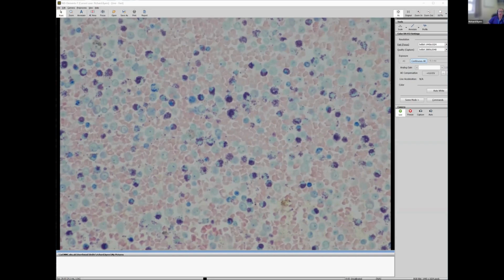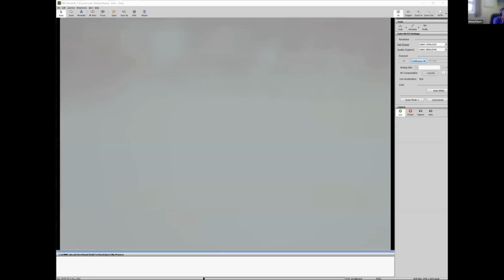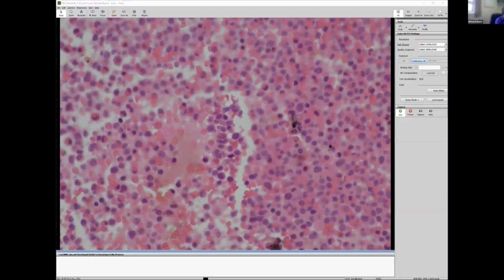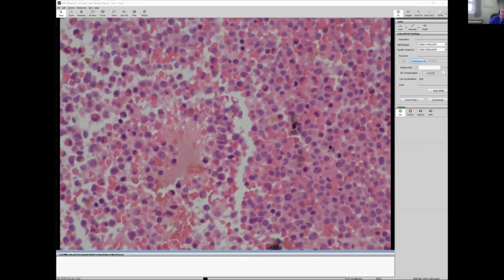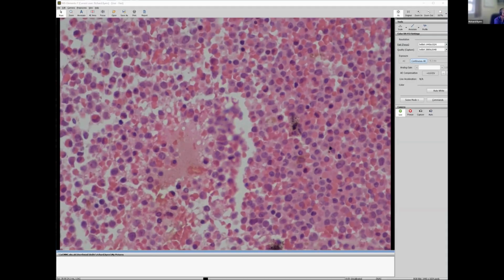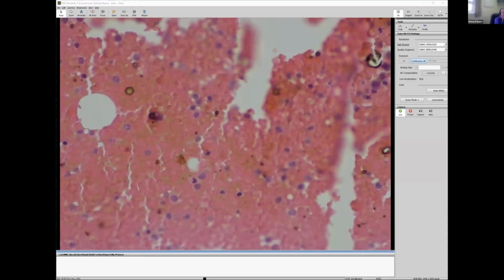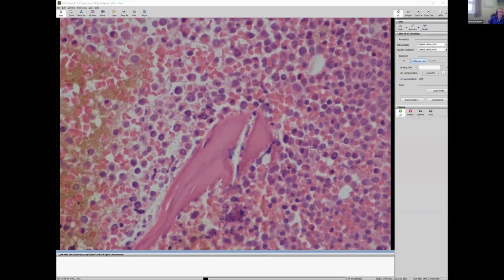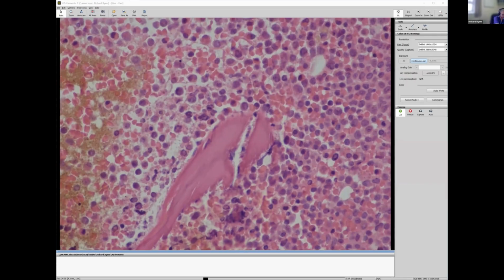Okay, yeah. Going back to the H&E, there's a large amount of eosinophilia. I think a very high percentage of blasts, pretty much all the cells are blasts. My colleague reported it as about 30% blasts, actually. So we've got all these blasts, with no real myeloid differentiation. That's probably the most mature cell there, a band form, nothing else.